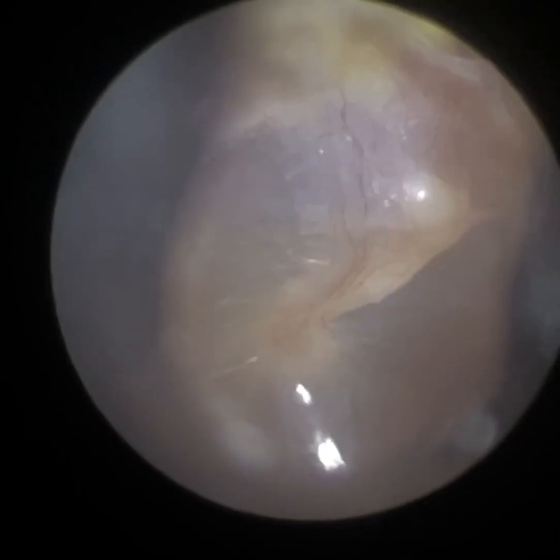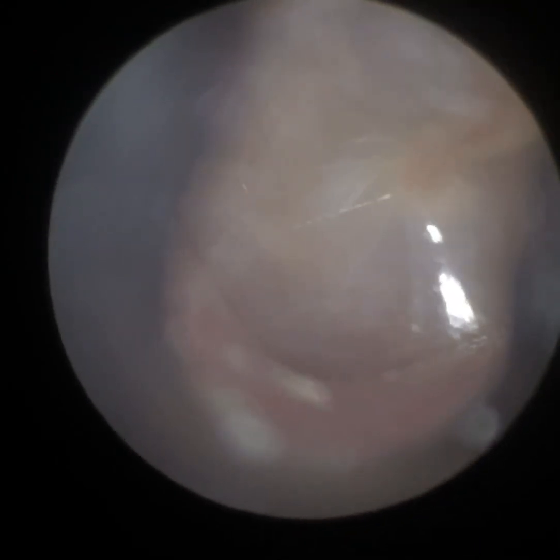There's a stunning view of the eardrum — I've just got it in focus. You can see all the blood vessels there. You can see the hammer bone. This is the same patient; this is their left ear.